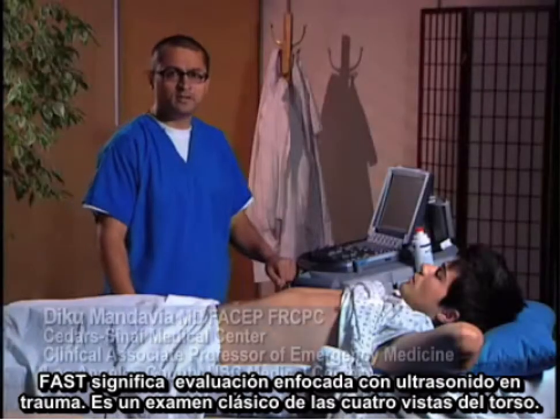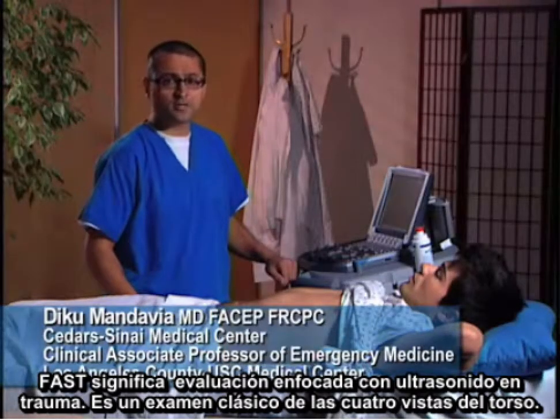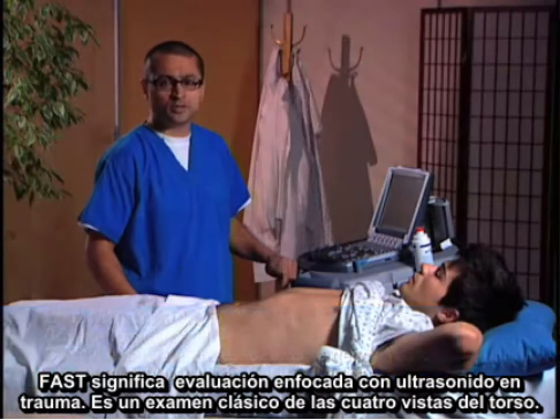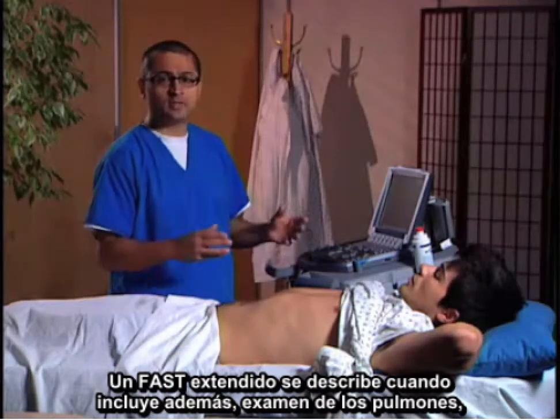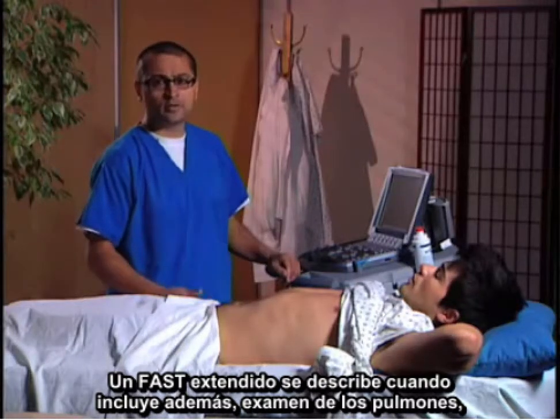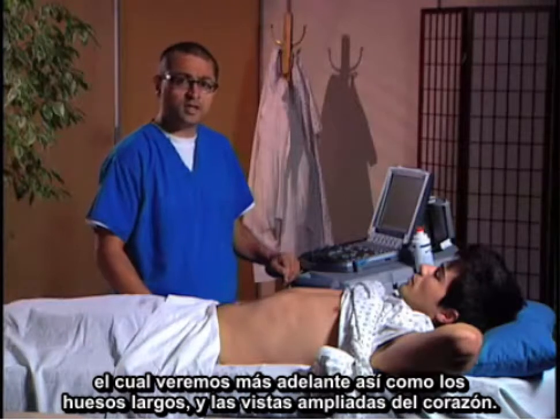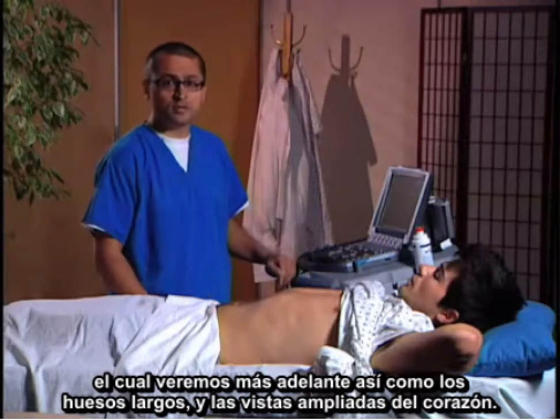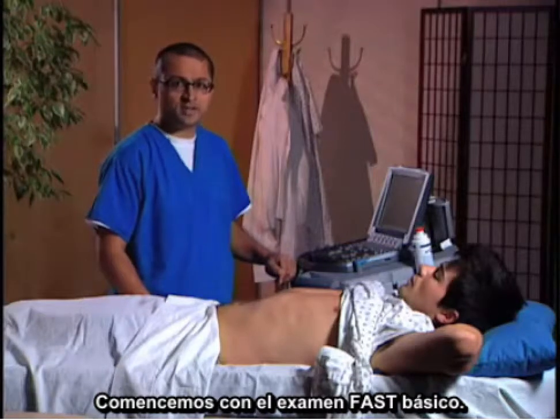The FAST exam stands for Focused Assessment with Sonography for Trauma. It's a classic four-view exam of the torso. There's also an extended FAST that includes further examination of the lungs, which we'll cover in a later segment, as well as long bones and expanded views of the heart. Let's go ahead and start with the basic FAST exam.